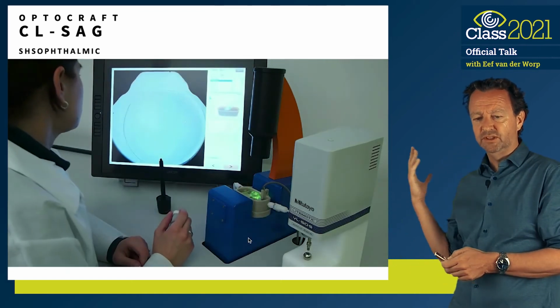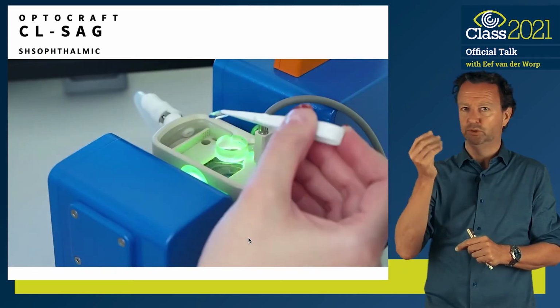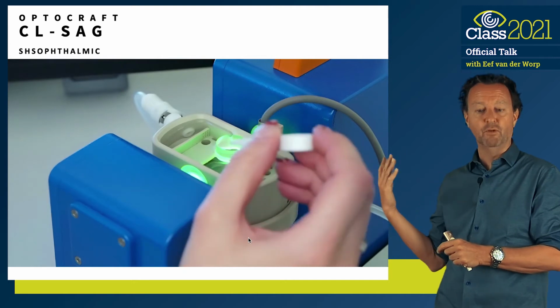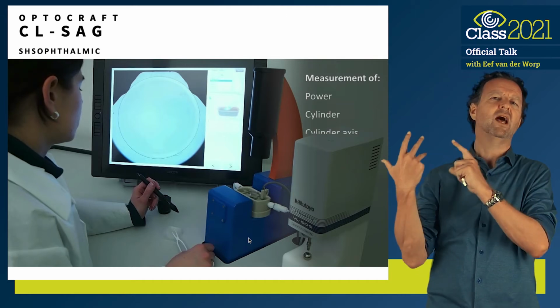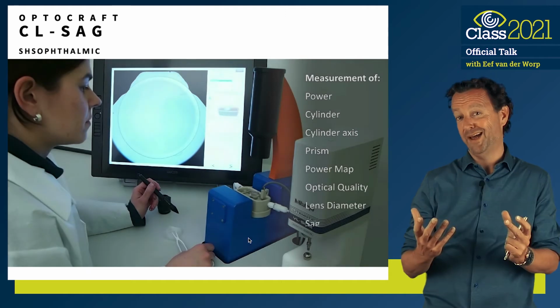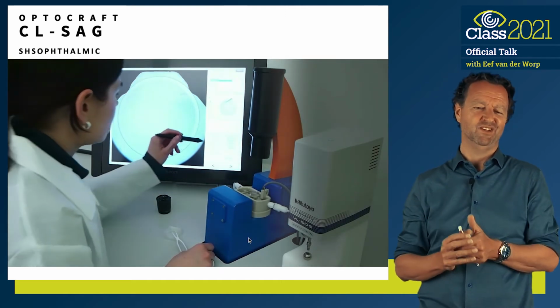So this instrument, it's a very stable instrument. It stabilizes that temperature very accurately. And of course you have to put the lens in a soft cell, which they do here, and then you can analyze all these parameters that are showing here, which is nice, but we're really interested in the sagittal height of things.